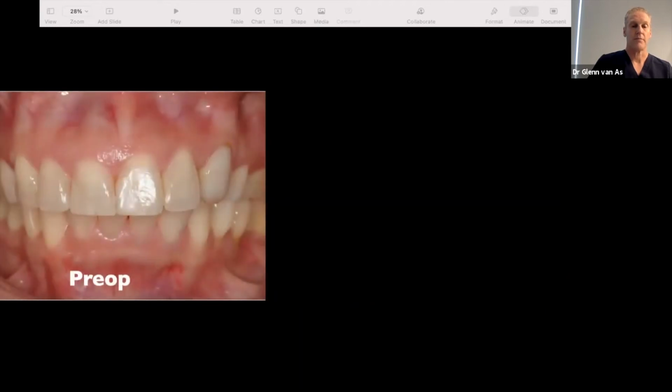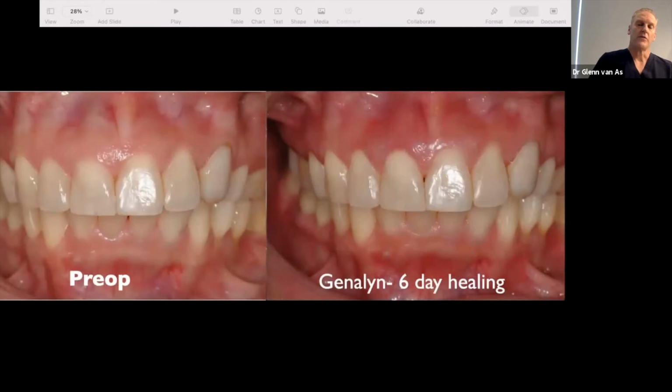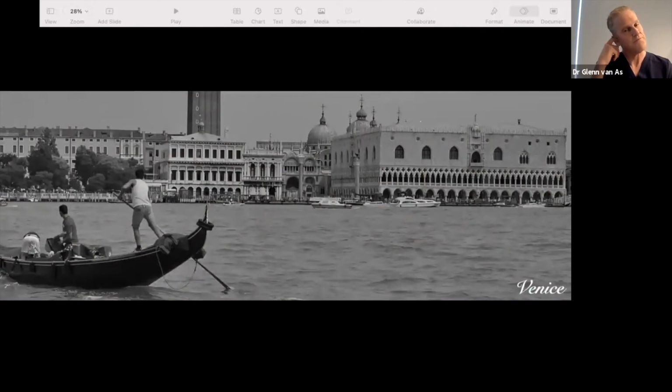Pre-op, 6-day healing. So in situations where you want to lengthen a millimeter and a half, closed flap crown lengthening can be something that can be an alternative. You have to be careful, and I'm not going to propose this to you for massive crown lengthening. If you want to do that, please feel free to raise a flap and do your traditional full flap thickness and full bone resection. This can be used for mild cases where you fracture a premolar cusp and you don't know, is that tooth salvageable or should you be placing an implant? How far subosseous is it? Can you get a margin on there? These are the kind of things where crown lengthening like this can be valuable.